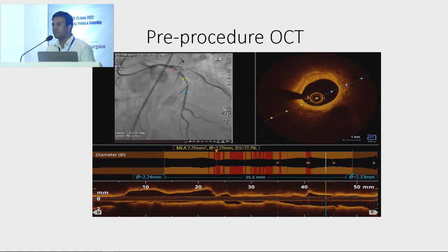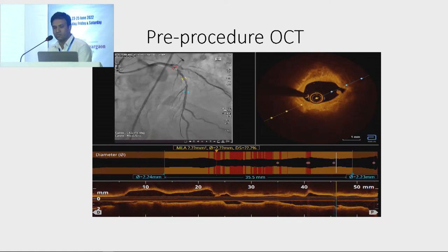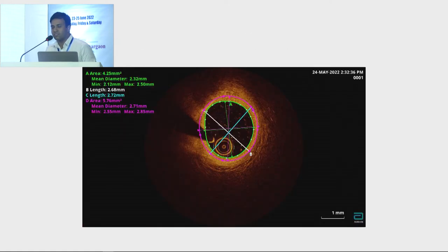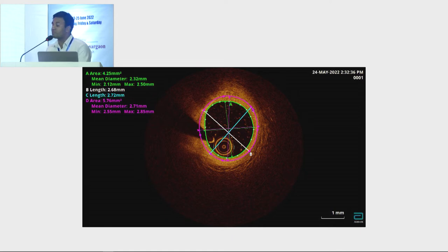So we could identify two landing zones: the distal landing zone and the proximal landing zone. This is how we measured the distal reference diameter — it was 2.7 mm. The proximal reference diameter was around 2.82 mm.